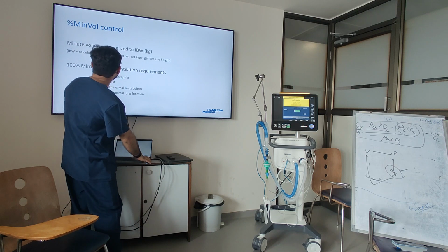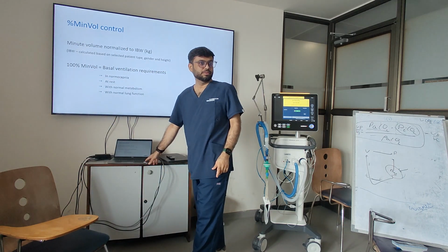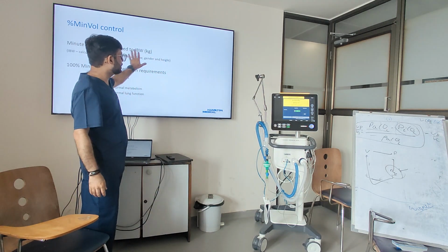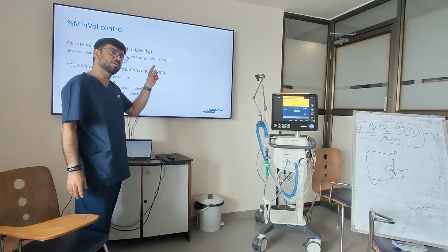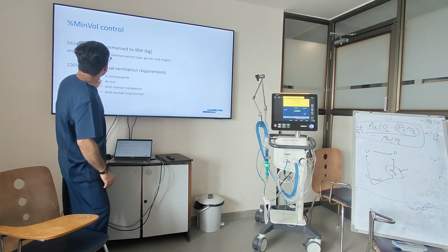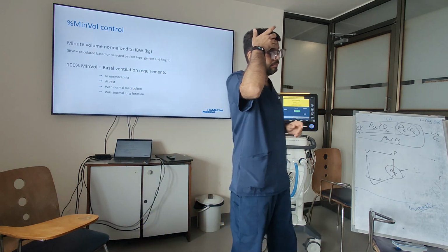So he wants to know the other three also. The other three will come separately. Actually, I just focus on the first parameter. I'll explain that later. Those parameters are for synchronization, ETS and the PEEP and all, which will come. In short, ETS is expiratory trigger sensitivity. 20 to 40% is what you want to do.